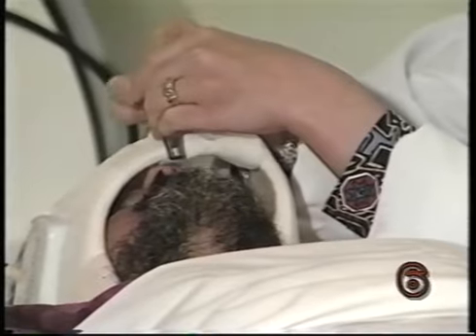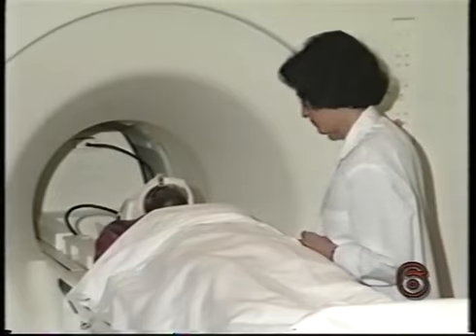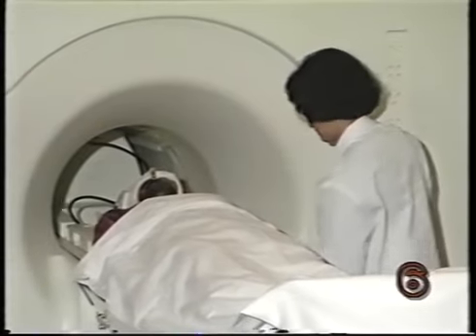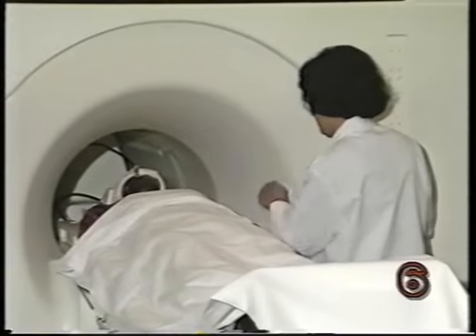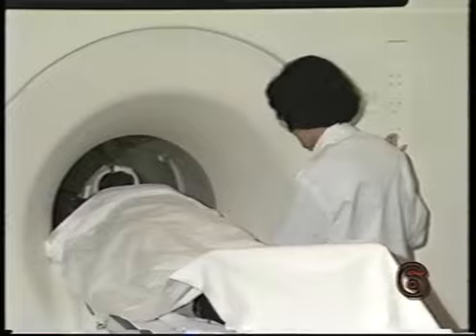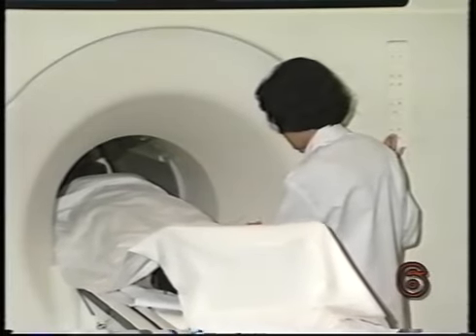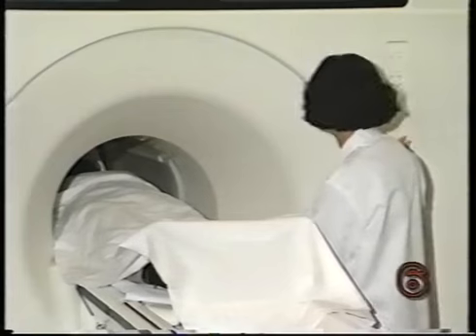The subject is positioned with the head secured and oriented in the sagittal plane. In the original speech experiments, acoustic recordings were made just preceding and immediately following the noise of the acquisition sequence. In subsequent studies, shorter acquisition time and the development of gating technology allow acquisition of acoustic recordings between segments of acquisition noise.